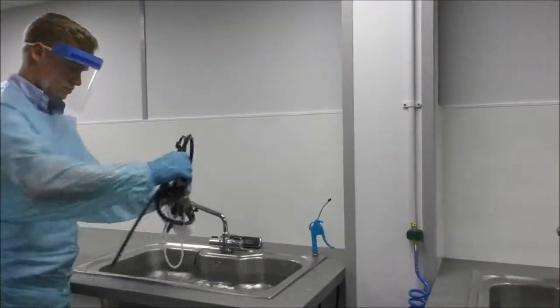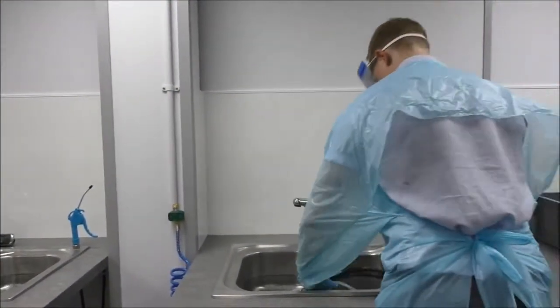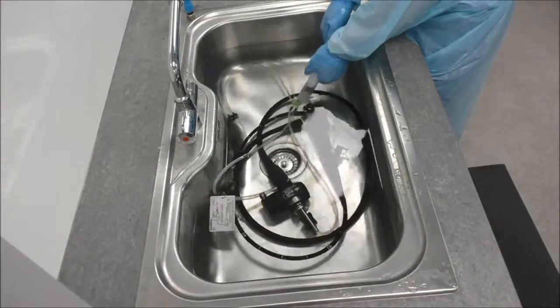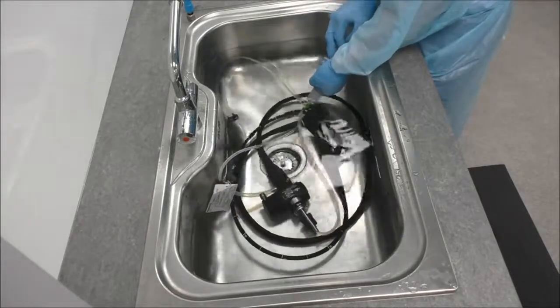Then transfer the endoscope from the detergent filled basin into a basin of clean water. Draw clean water into the syringe and flush the channels 3 times.